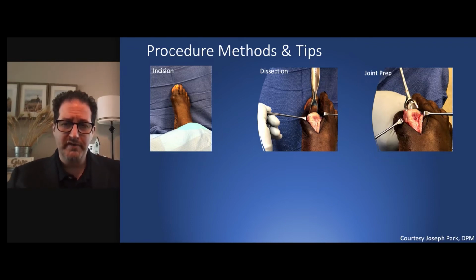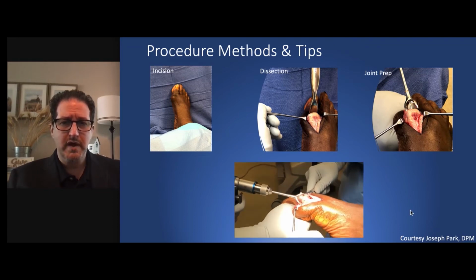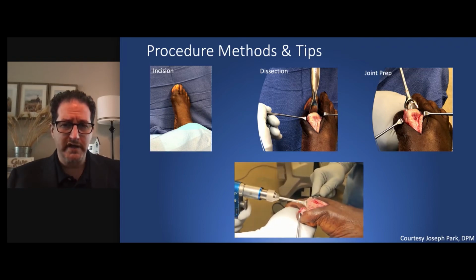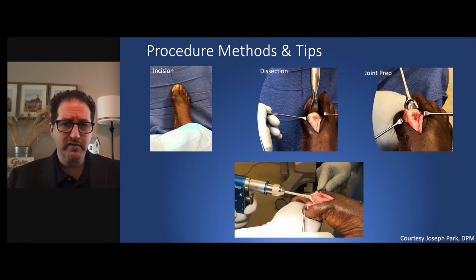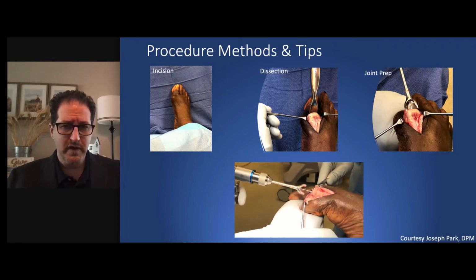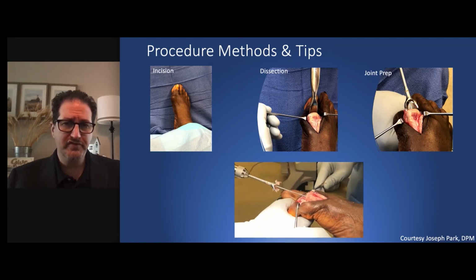This is the cup in this case, and I'm going to show you this video of Dr. Park doing the fusion procedure, and you'll notice that they're not just pushing hard on it. You start the reamer and you run the reamer, and you gently remove the tissue. It's very easy, especially if there are cysts inside the head, for that reamer to crush the head, and then you lose all of that joint material.